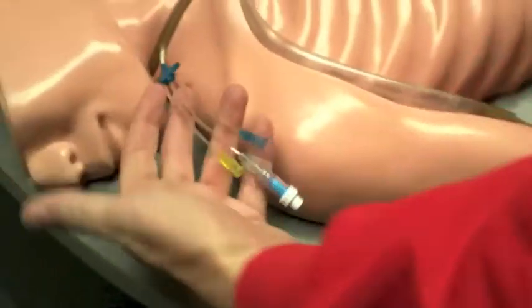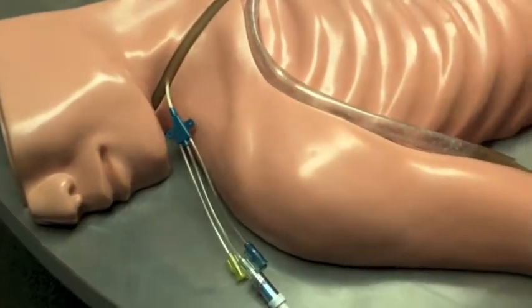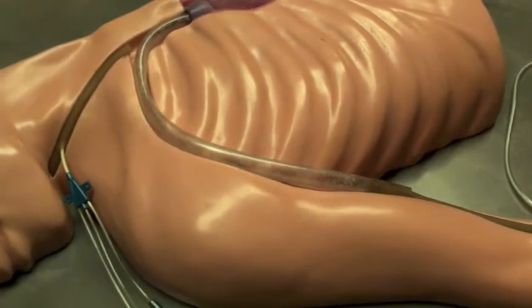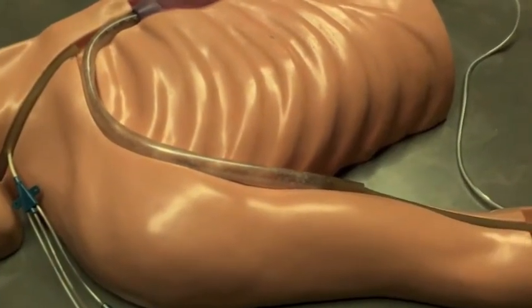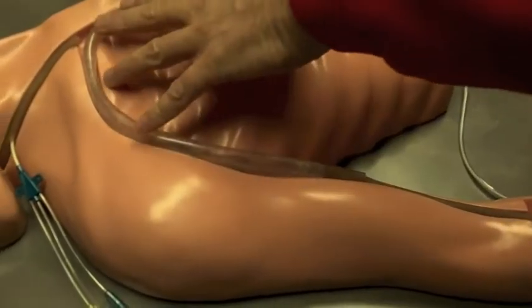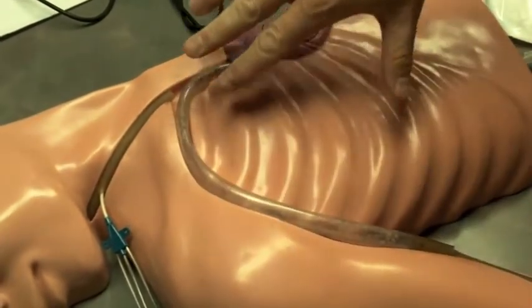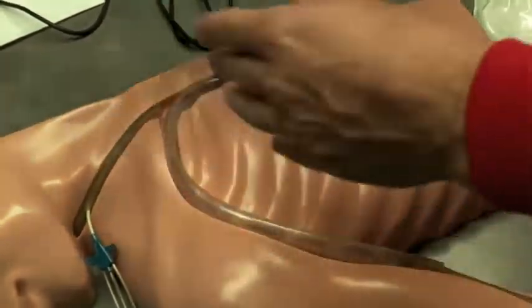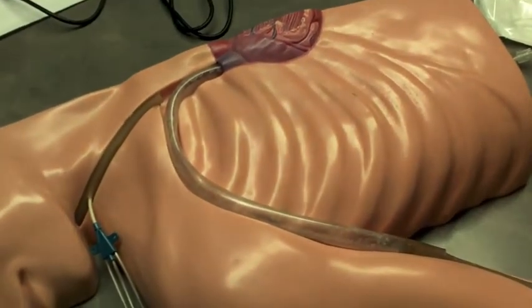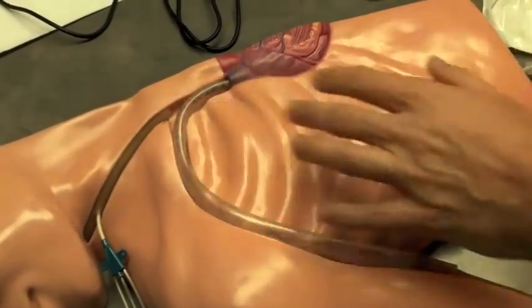What you're looking at is a central line — they put that in your neck to determine your central venous pressure. A blood pressure cuff is non-invasive, but if you really want to know what your blood pressure is, you have to go in. You're actually measuring the superior vena cava — basically the New Orleans of the veins — where all the veins gather before entering the heart. That gives you the return pressure, not just arterial pressure. That's invasive blood pressure monitoring.